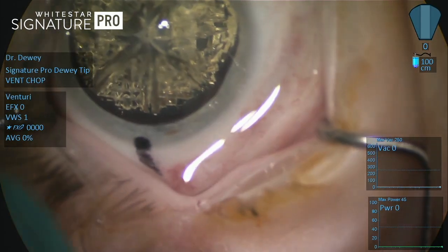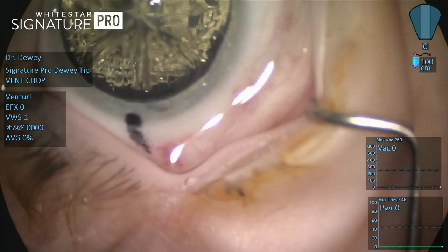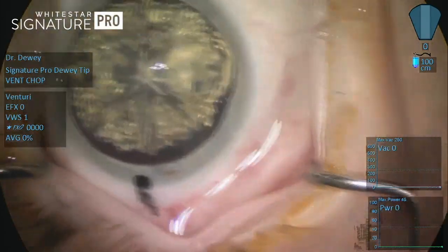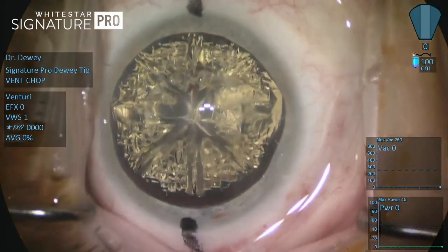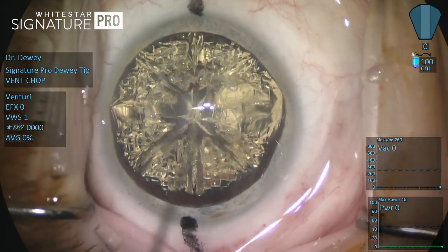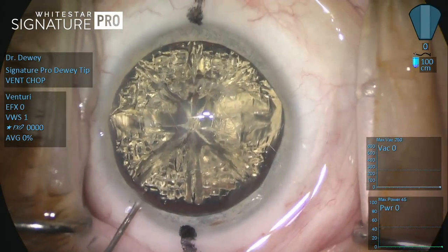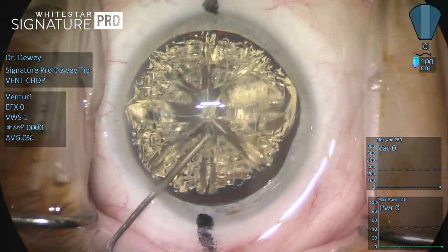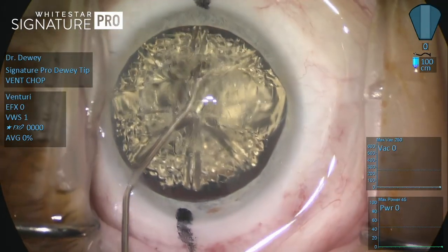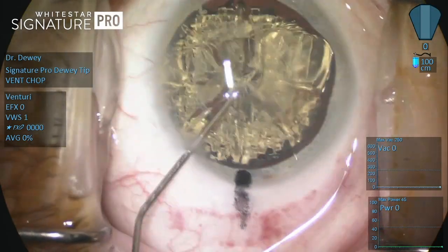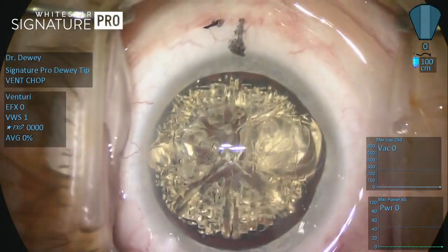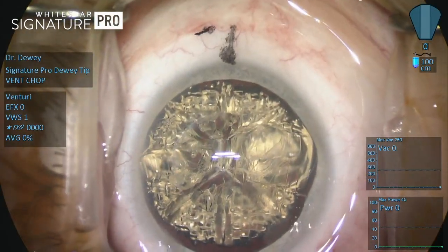The advantage of softening the lens is the conversion of the solid nucleus into partially adherent columns. A potential issue is that the fragments of nucleus are now no longer able to fully occlude the lumen of the needle, and that's where venturi vacuum can really shine.